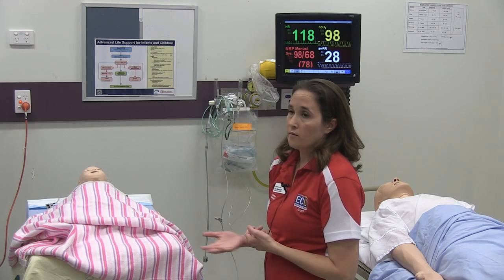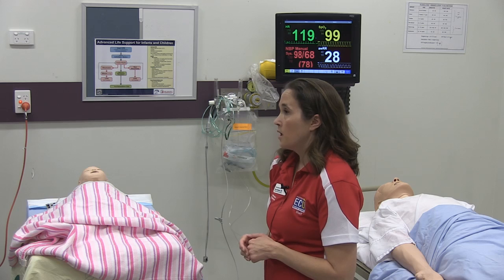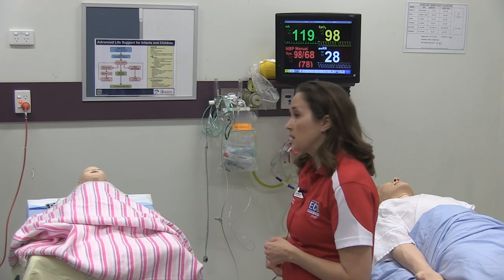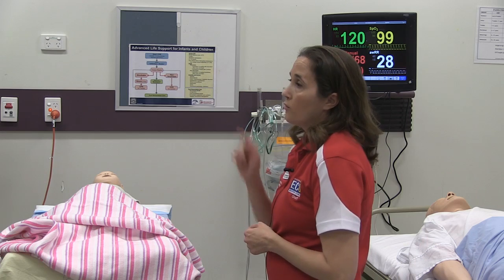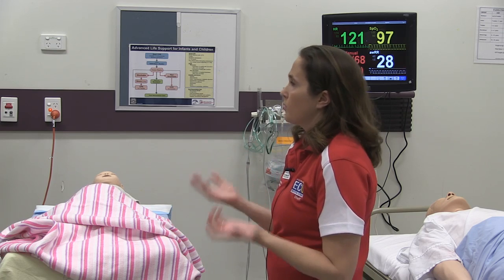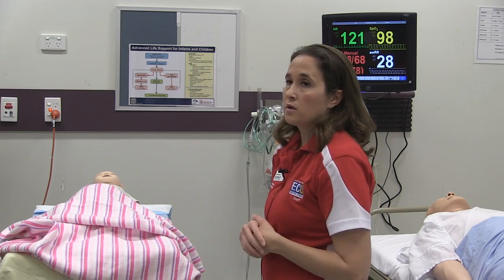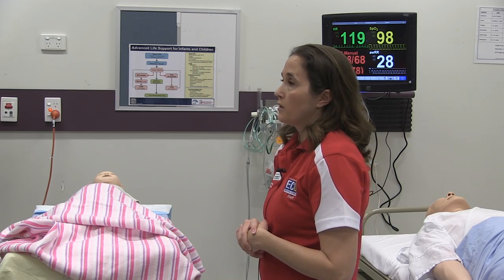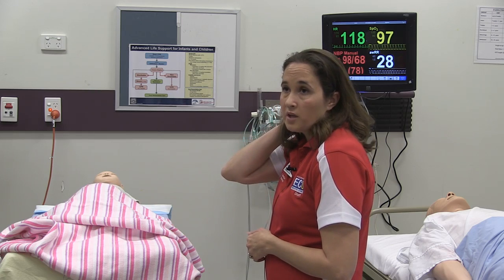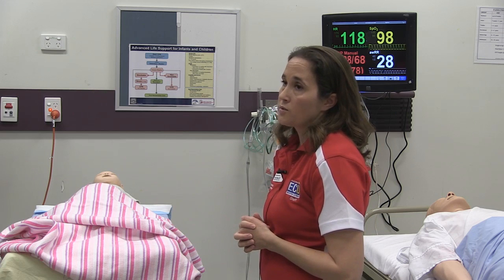The other aspect of a Confederate's role is to help guide the scenario if the scenario is going off track. We have our Confederates wear earpieces and radios, much like this, but it's a one-way communication. So I communicate to them and they don't communicate back to us, just to keep it real. Obviously if they were talking back answers to the air, that would look a little strange. So it's just a one-way communication point, but it allows me or whoever's running the computer or the simulation to guide things the way I want it to go.